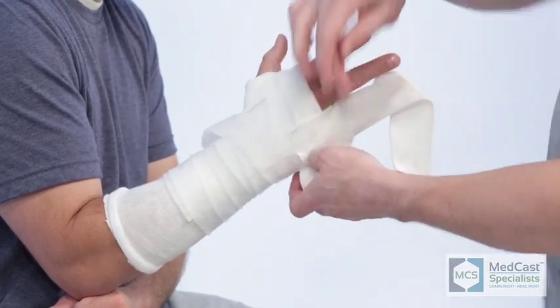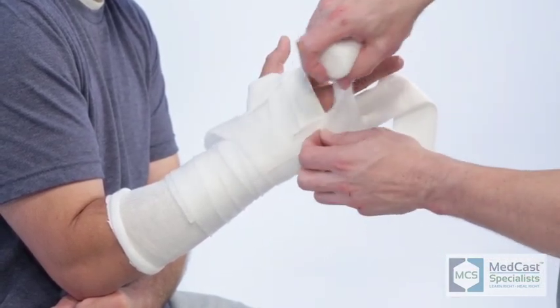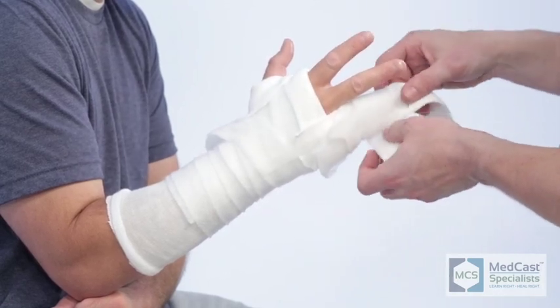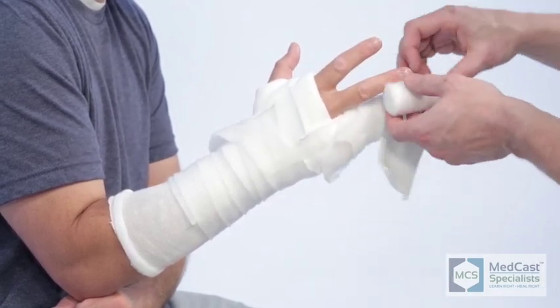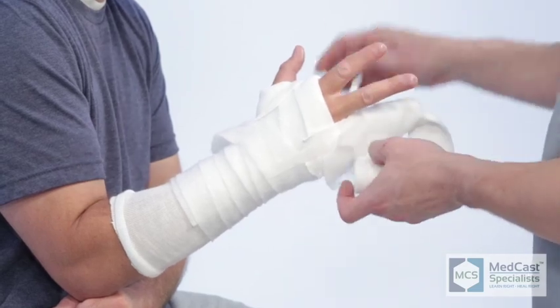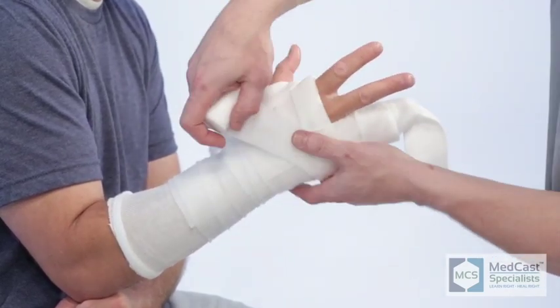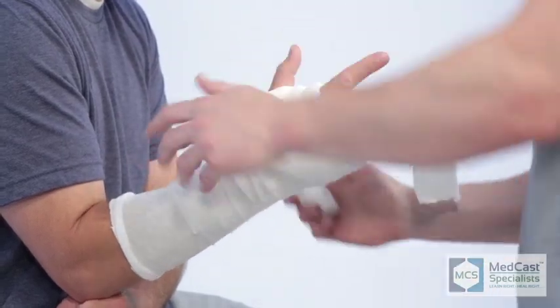A lot of people get a little confused when they get out to the digits — they're not quite certain what direction to wrap or how much to wrap. But once you get a system down and you know it will be reinforced and strong enough for the duration of the fracture management, you get a lot of confidence. These can be very intimidating casts to put on.